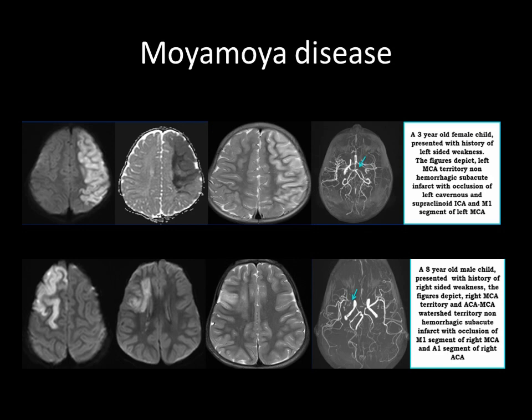In the first set of images, there was a three-year-old female child who presented with a history of left-sided weakness. These figures depict left MCA territory non-hemorrhagic subacute infarct with occlusion of left cavernous and supraclinoid ICA and M1 segment of left MCA.